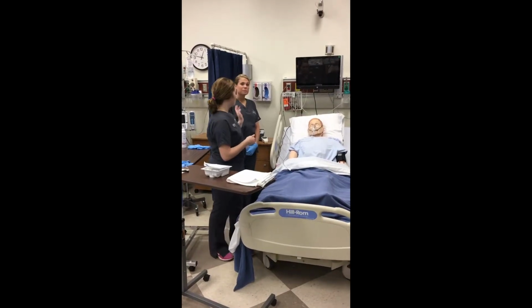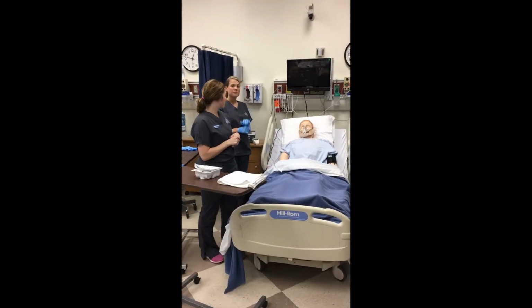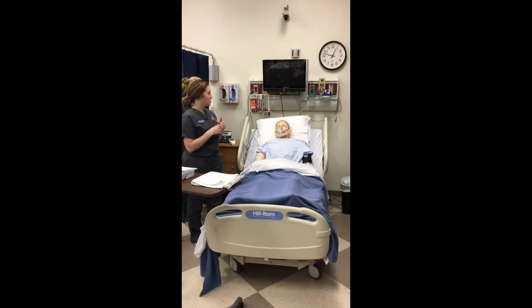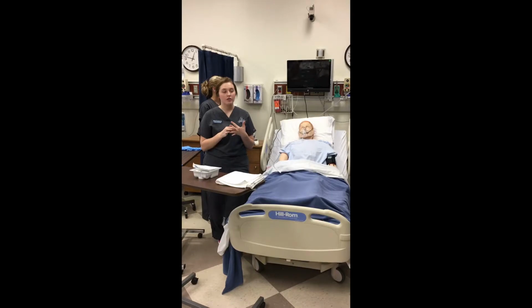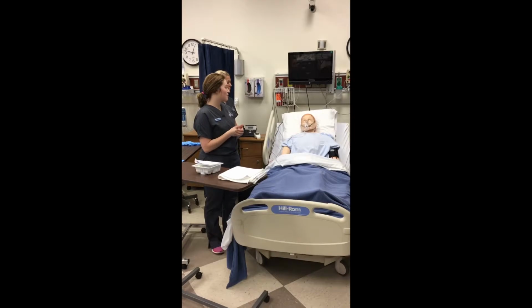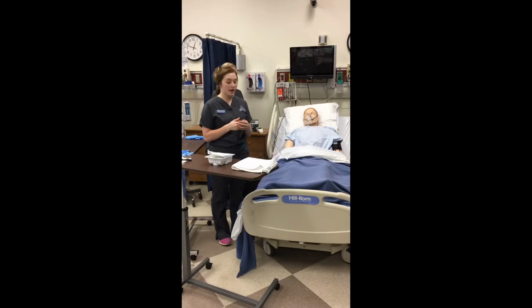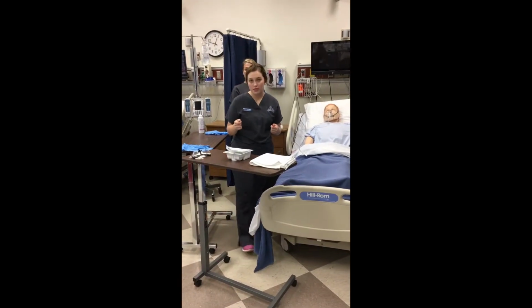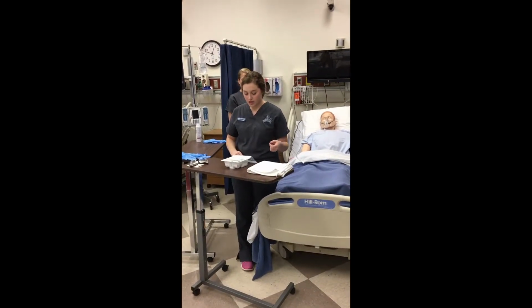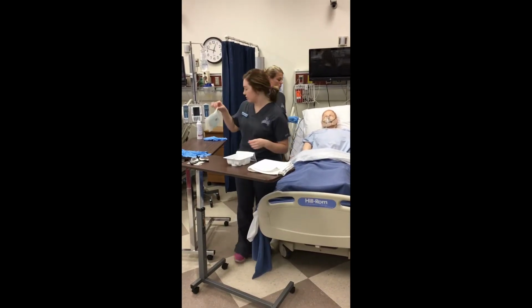I have a tech with me here today. She has performed hand hygiene and has on clean gloves. So now what I'm going to do is make sure that my wall suctioning is on to 80 to 120 millimeters of mercury, and that it is functioning properly. And now I am going to go ahead and open my sterile field, or my sterile kit, towards me. I'll reach in, grab my sterile gloves.